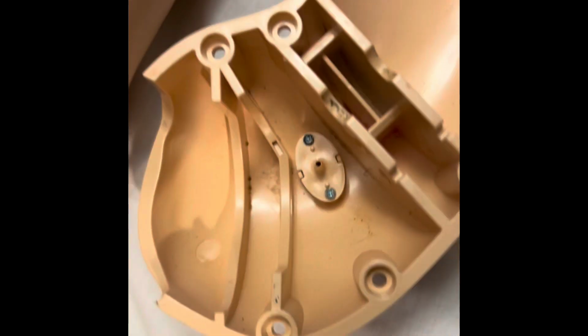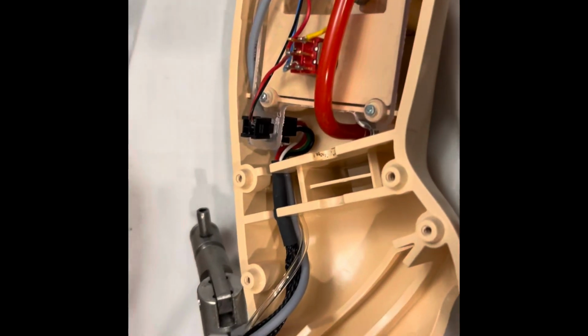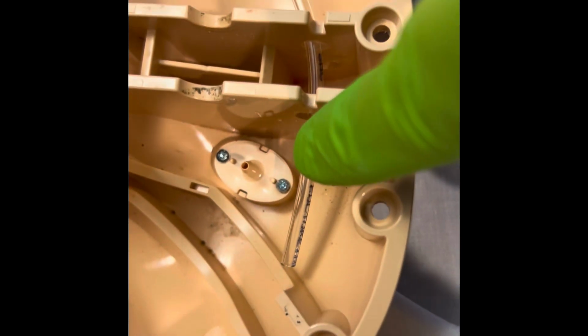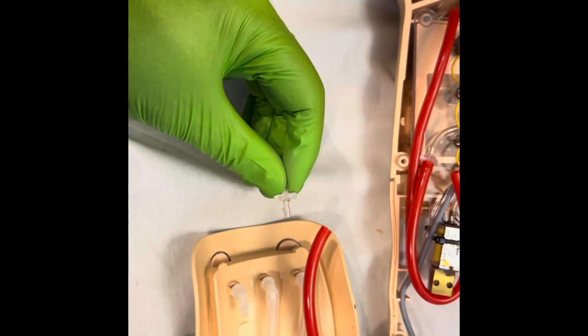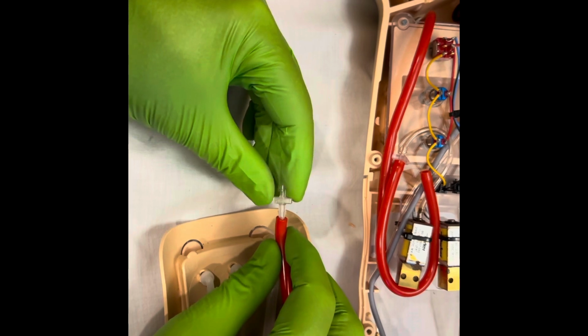Now you can see the port, or the hose will go through there. In that ballpark there. Makes it a lot easier. And then once you've established the length that you need, I apologize for my camera work. It is really hard to do this one-handed. Once you establish what size you need, go and cut off an extra and then attach it to the end port there. So now I'm going to connect the red hose to the fitting here.